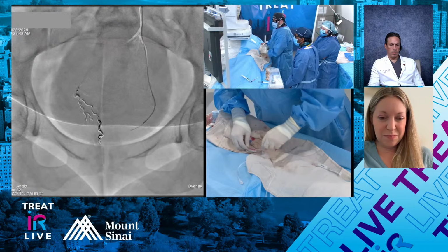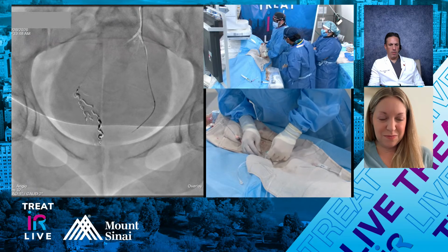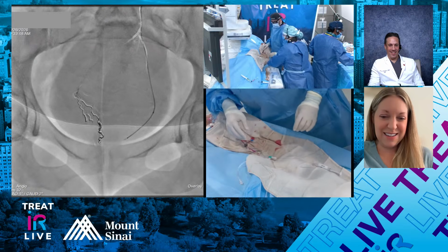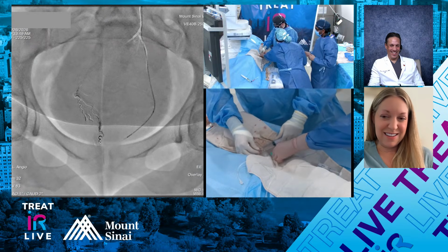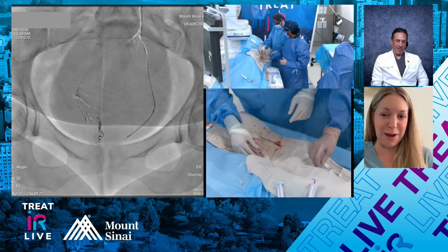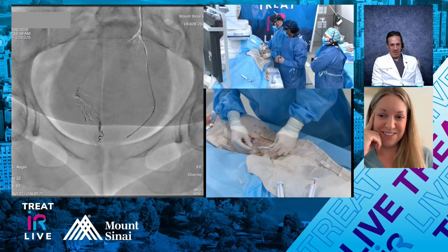All right, Dan. Well, I have to use a wire. Jay just sends the microcatheters expertly, and apparently it magically knows where to go, and shaped microcatheters go wherever Jay wants them to on command. The only thing in my life that listens. Dr. Vidal doesn't use a wire either. He just sends it down. I mean, he's magical too, I guess. I'm a peasant who needs a wire sometimes.